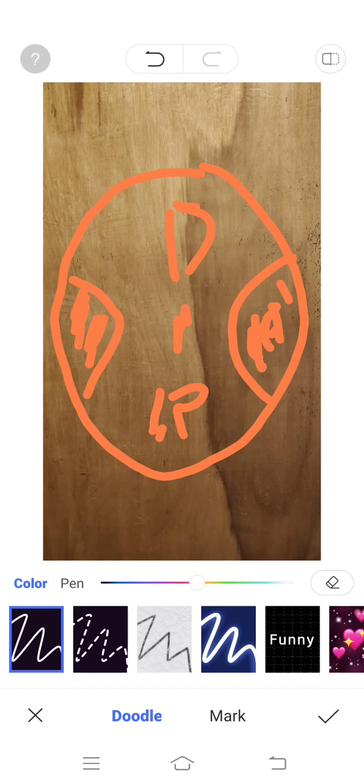That's the reason why a lot of the patient will feel discomfort using the progressive lens, especially for first-time wearers, because when you use progressive lenses, you have to use head movement. When you gaze from left to right, you have to use head movement and not just eye movement. Because if you use eye movement, your eye will hit this area on the side, the distorted area.